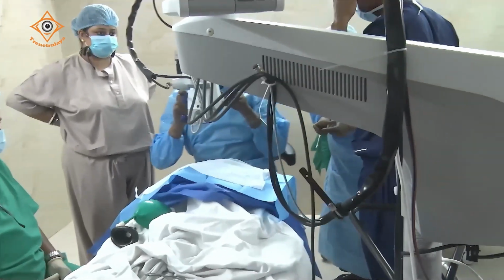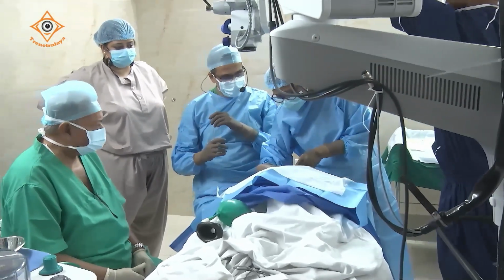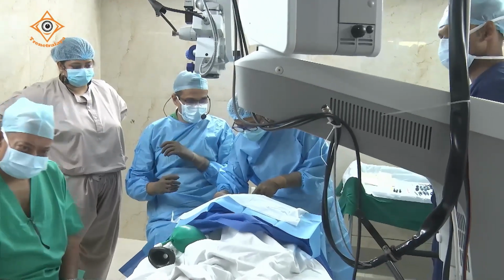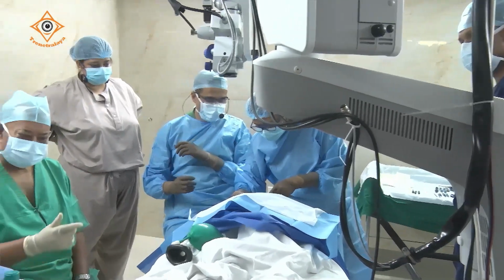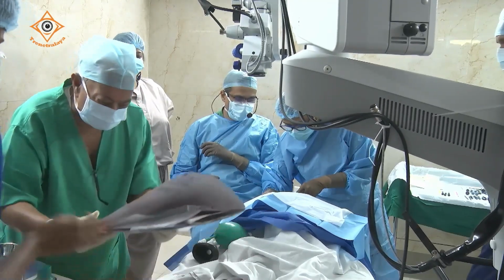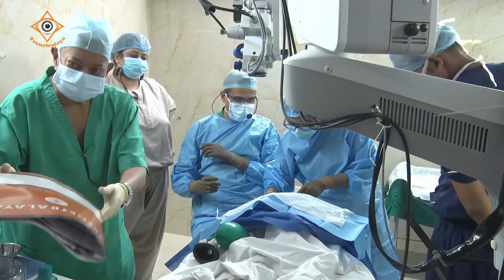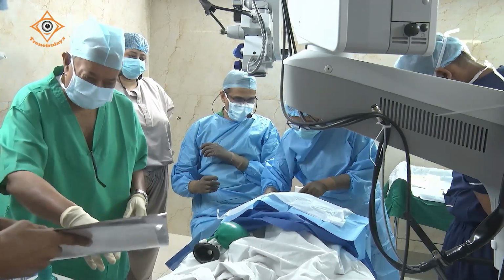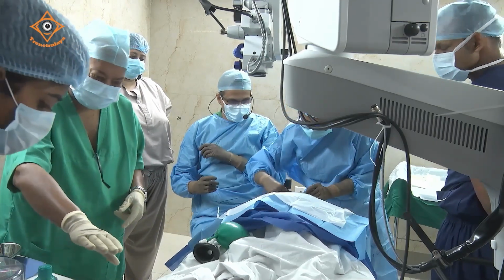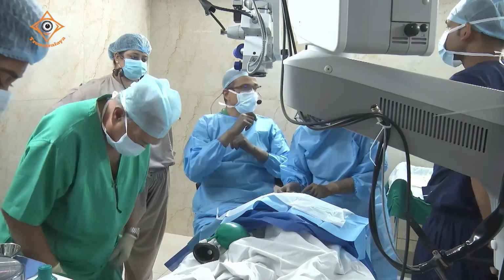What I would be interested to know is whether or not a refraction has been done in the pseudophakic eye. Yes, and the IOL had gone into the other eye. That would definitely help us to tweak the IOL power in this eye, because we won't like the child to be too hypermetropic at this age, because the near vision will be compromised. So has that been done? Yes, the other eye has been refracted, and it was plus 2 diopters of hyperopia. What was the power of the IOL which had gone in the other eye? 28 diopters.